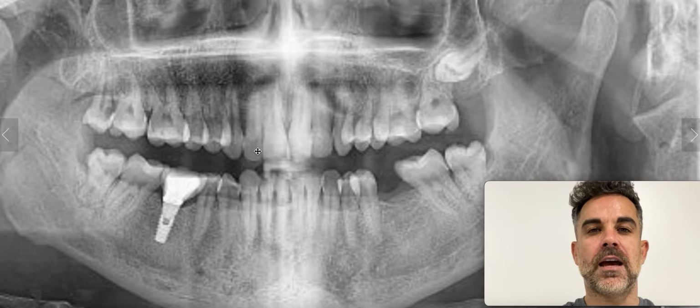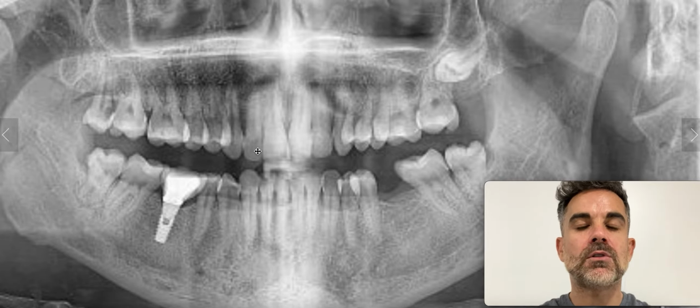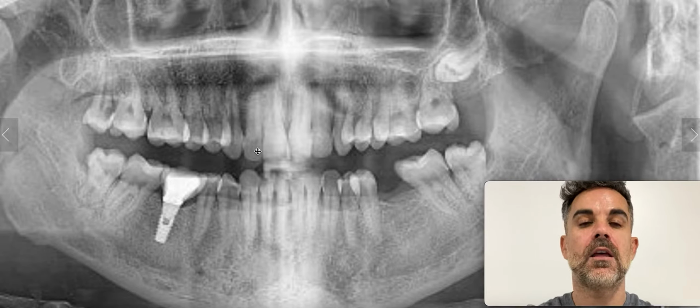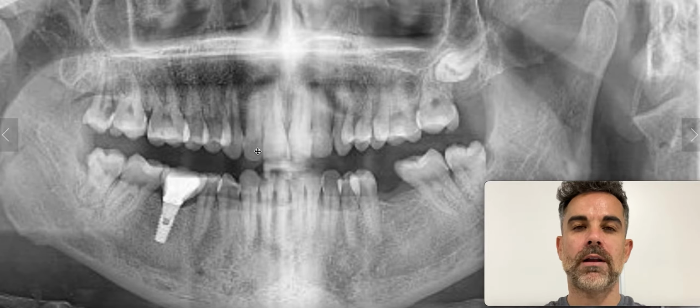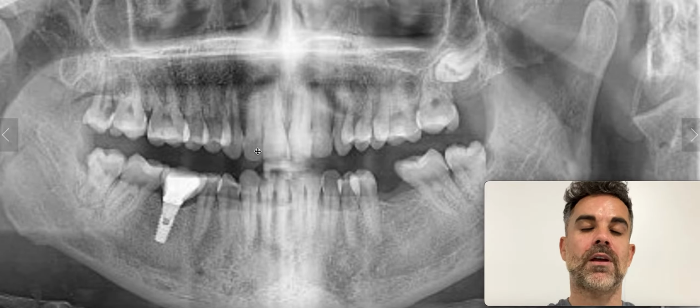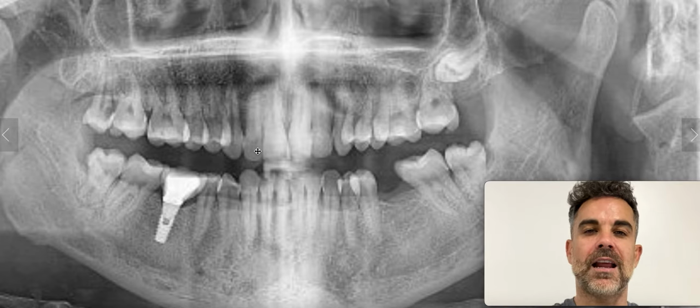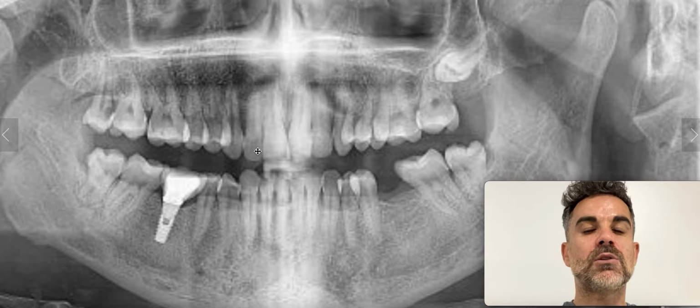In patients with a sagittal problem, in which we have to address a class 2 or class 3 malocclusion, we usually have to decide where to bond the elastics, the intermaxillary elastics. They're usually bonded on the molars of the quadrant used as anchorage, usually the upper one and the lower one in a class 3 and class 2, and upper canines in a class 2 for the distalization of the upper arch, and lower canines for the distalization of the lower arch in a class 3. But in some cases, this might change because of the situation of the patient.